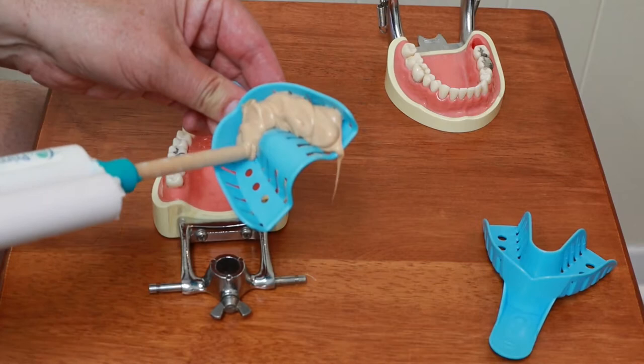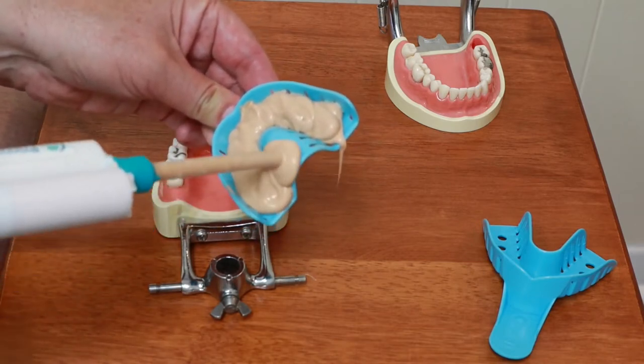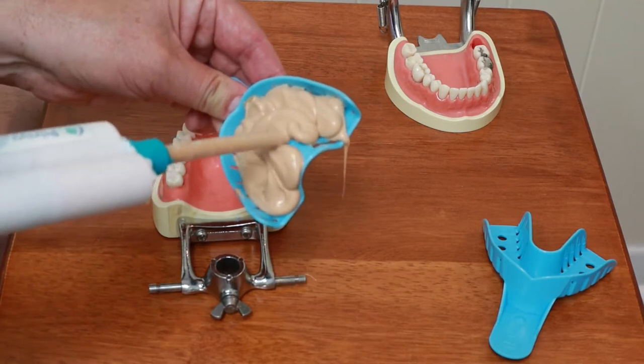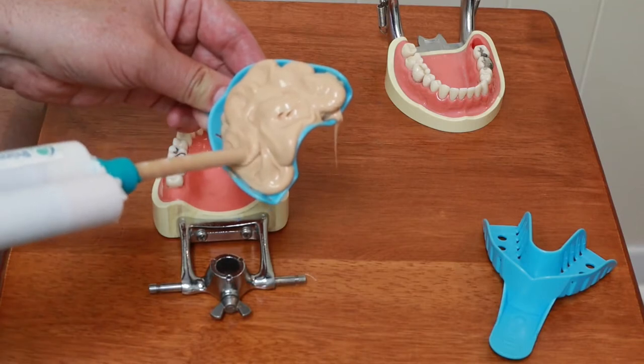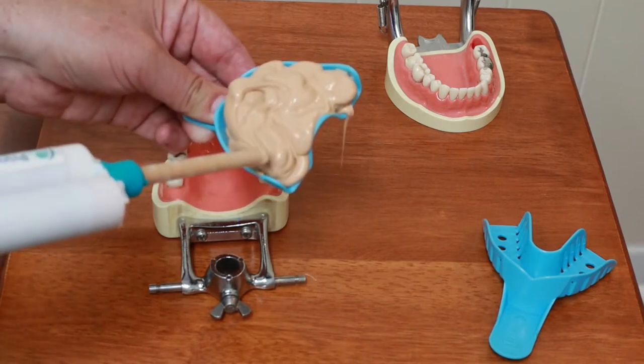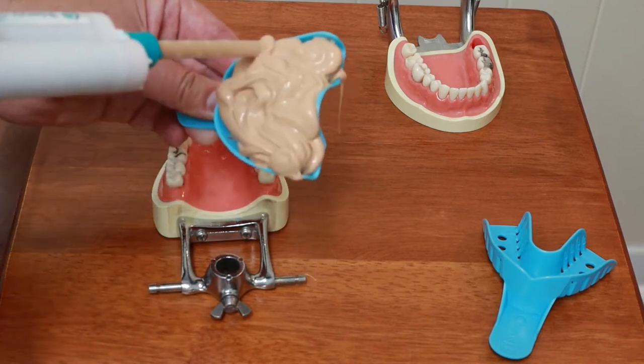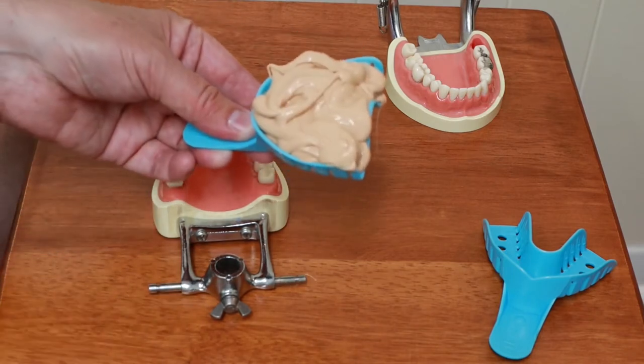Almost like I'm caulking. Years ago we had to mix this by hand. It came in tubes and mix it up on a piece of plastic paper with a spatula and then put it in the tray. Now with the guns it's much simpler. A few more years and we're just going to be using digital scanners most likely.